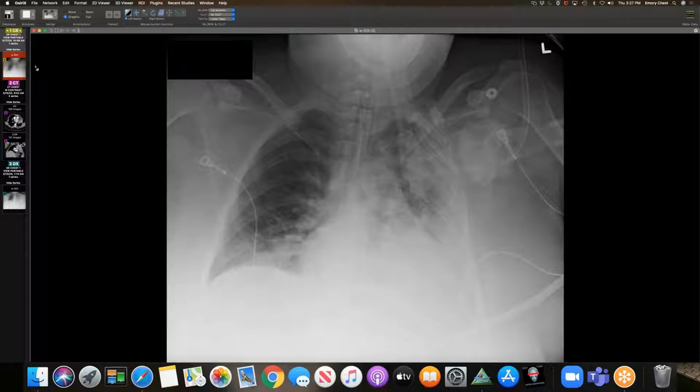Another person had a bunch of scarring in the lungs, probably from old infection, and we had an earlier CT and it didn't show any change from something that was done years ago. So there's just a whole lot of miscellaneous abnormalities that you can pick up on CT if you do it, particularly in old people who acquired lots of lung problems over the decades. So there are a lot of non-specific CTs, and more than half of my CTs have abnormalities that are not related to COVID, even despite nose positivity.